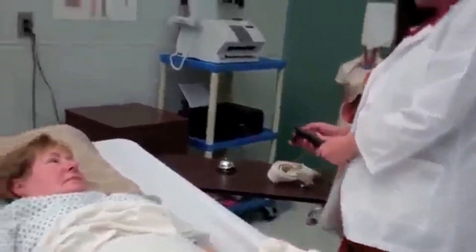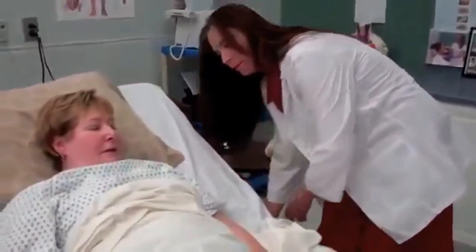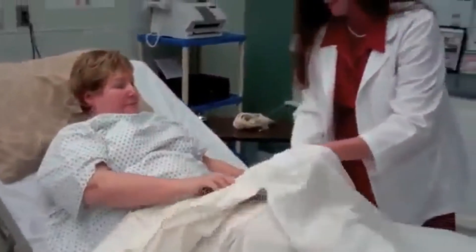What I'm going to have you do — I'm going to lift this head up to make it a little bit easier for you to swing over to this side. So I'm going to get you out of your bed. All right. Pull your dress down here.